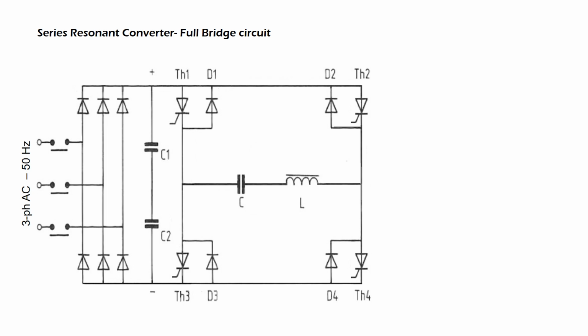For technological reasons, the thyristors TH2 and TH3 can fire only a few microseconds after zero crossing. For this time, that is, the so-called recovery time, the flow of current is taken care of by the diodes D1 and D4.